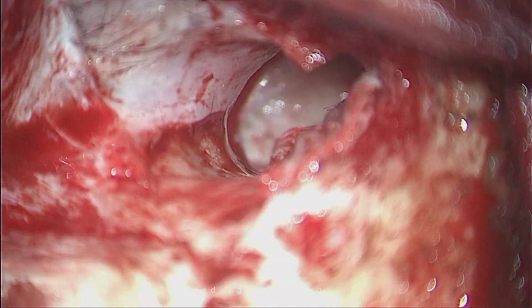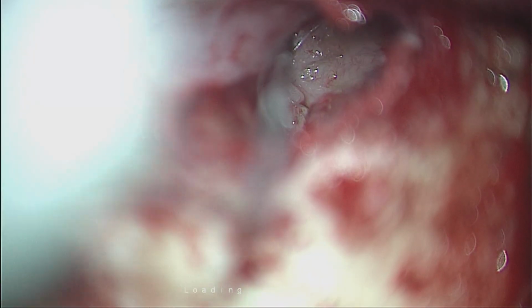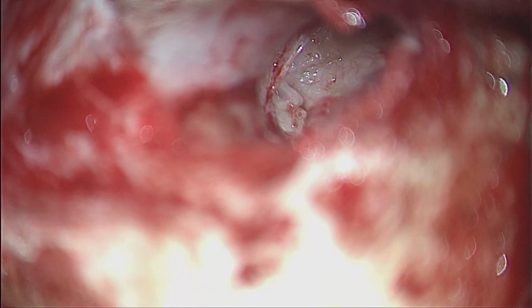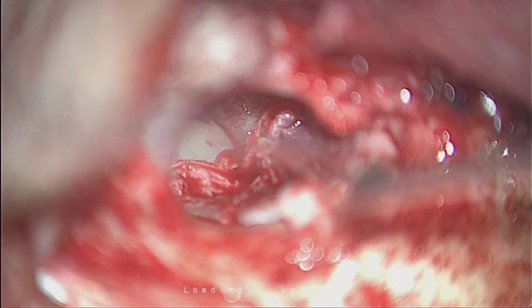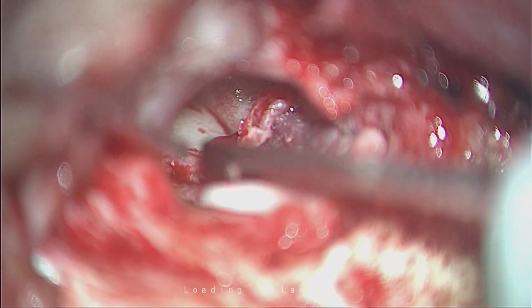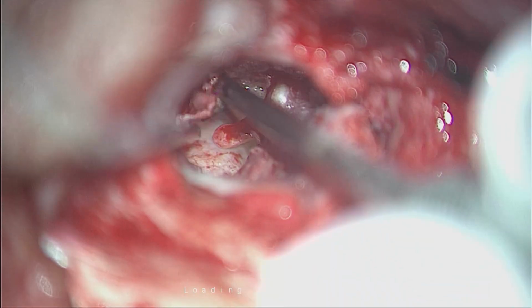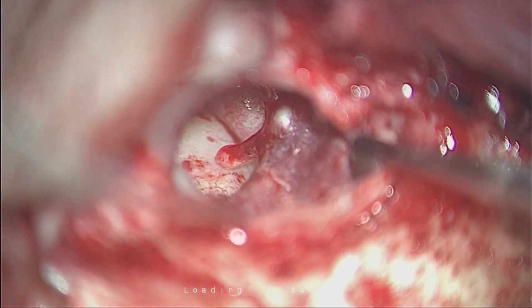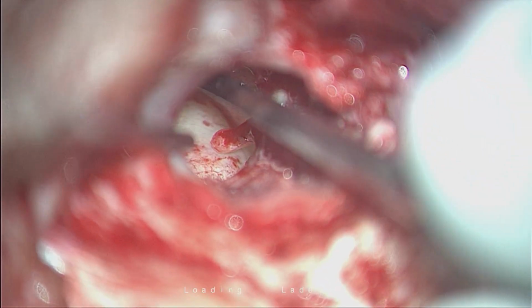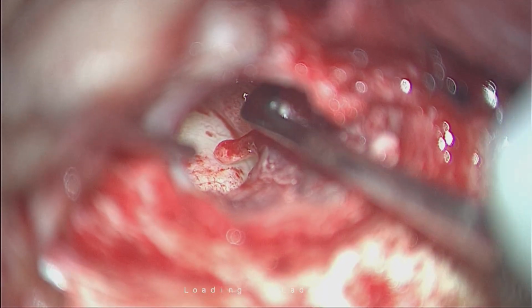Can you see everybody? All around. See this? Mucosal layer is left below. Mucosal bed for the graft to rest. So my graft is going to sit on that mucosa in the canal, so as to prevent or sustain any sort of negative pressure which can draw the graft medially, which can happen in the underlay technique if that happens in the immediate post-op. So that is the additional security.